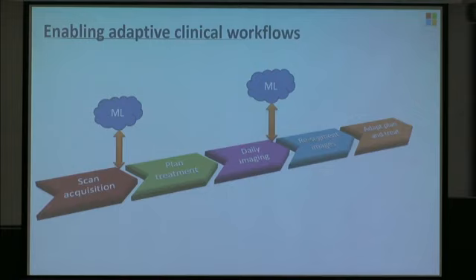So what we need to be able to do is change our workflow. We need to acquire the imaging, use the ML model in the cloud to quickly do our segmentations and plan the treatment.